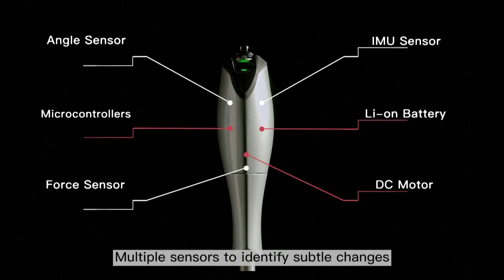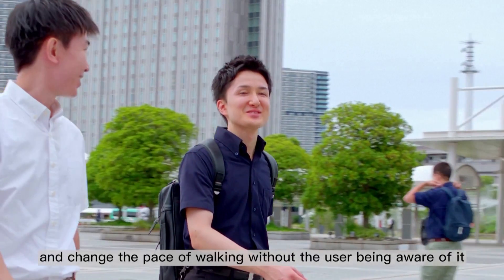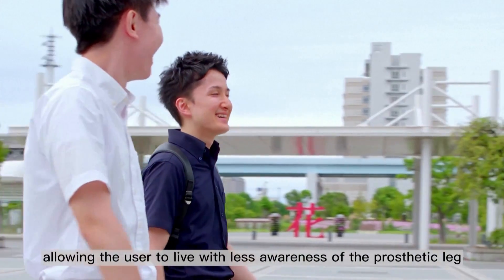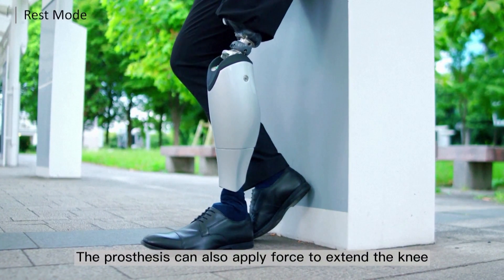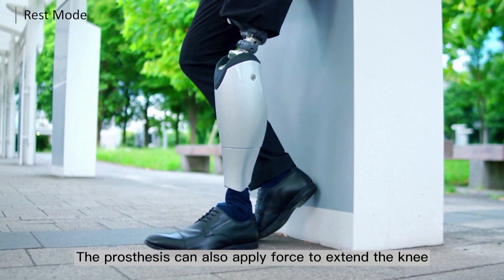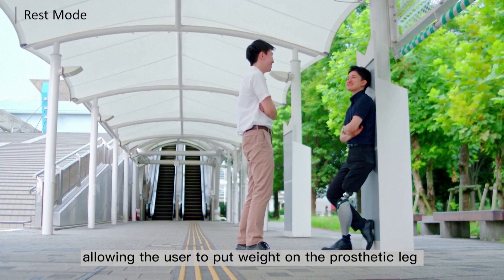Multiple sensors identify subtle changes and change the pace of walking without the user being aware of it, allowing the user to live with less awareness of the prosthetic leg. Even with the knee bent, the prosthesis can apply force to extend the knee, allowing the user to put weight on the prosthetic leg.